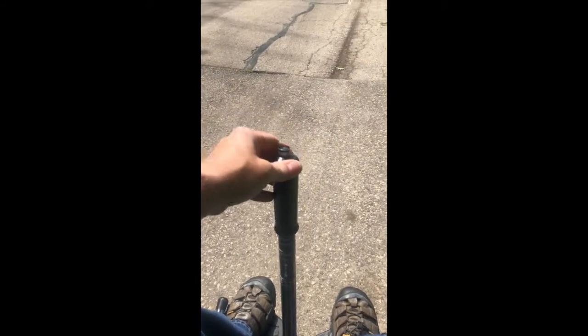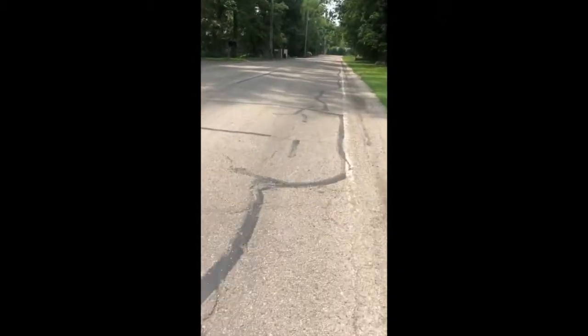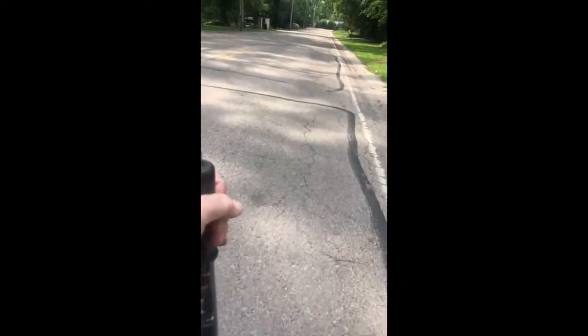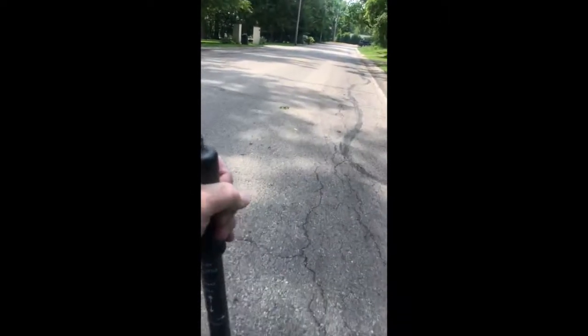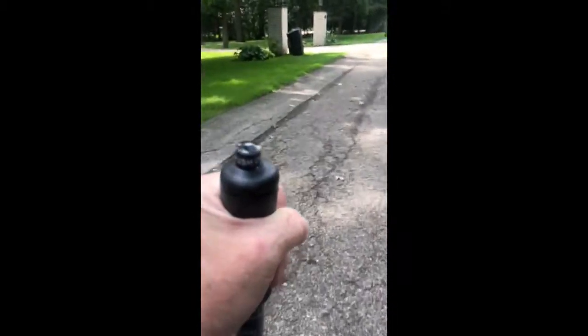Driving the Segway-powered wheel-share towards the landing. Go to the left, go to the right, go to the other side of the road — no worries. There's a walking path here.